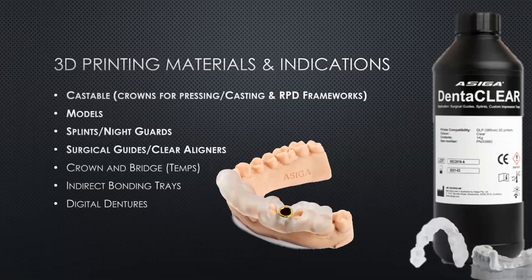So I absolutely love this workflow because the implants are designed from the top down rather than the bottom up. So you have perfect screw hole access, either lingually on the anteriors or centrally on the occlusal surface, right in the middle, dead center for posterior crowns. And you have a perfectly sculpted emergence profile for the final restoration as well.